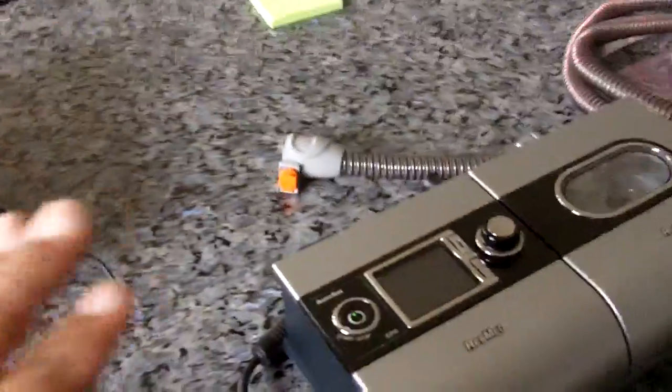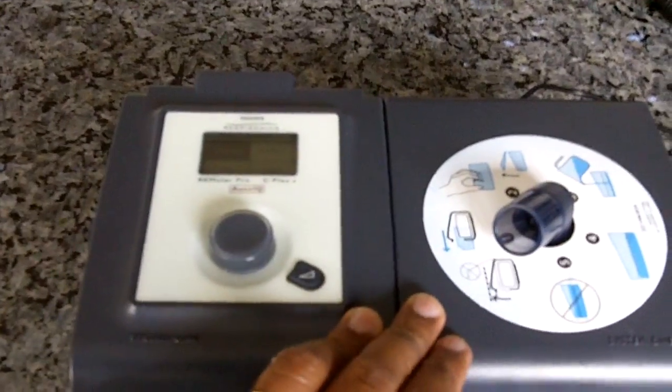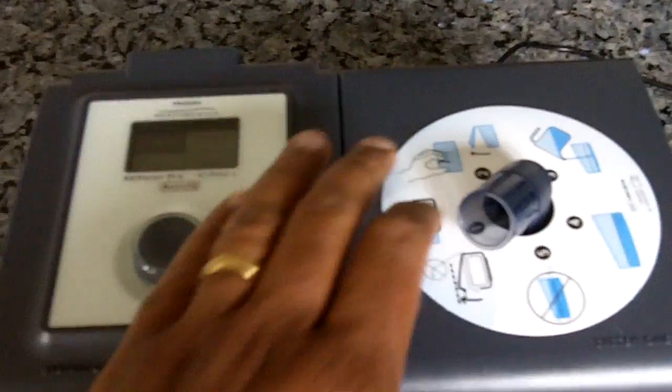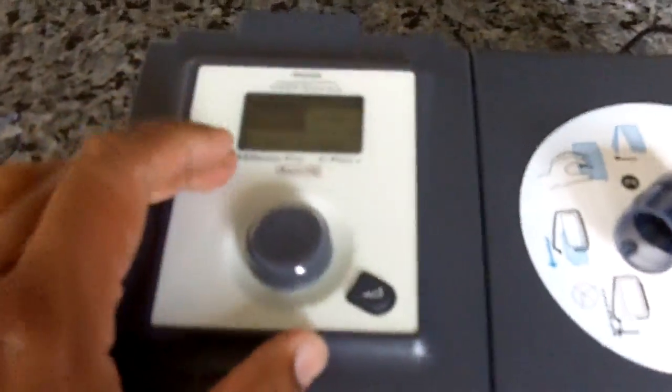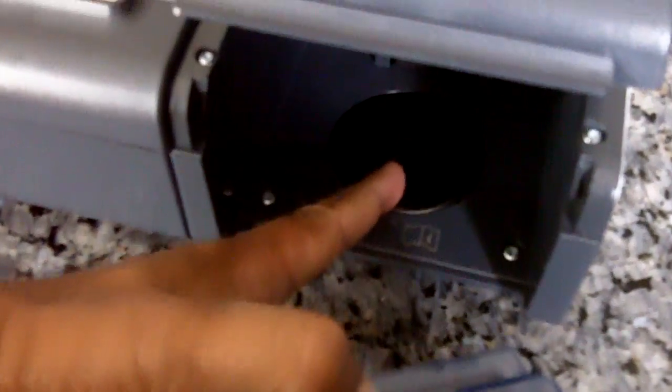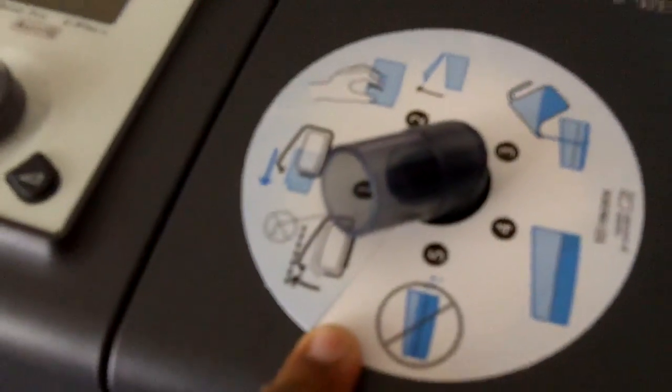So this is an issue. Water in the tubing is a major issue if you live in cold climates like New Hampshire, especially in the wintertime. Now, if you decide to not try to exchange the machine and just use your current machine, obviously use the preheat function, and if you find that you are not getting enough moisture, even though you are turning your heat level up, remember, the higher the number, the hotter the hot plate, the more moisture you receive. So once again, the higher the number here, this controls the heater, how hot the hot plate gets, the more moisture you receive.